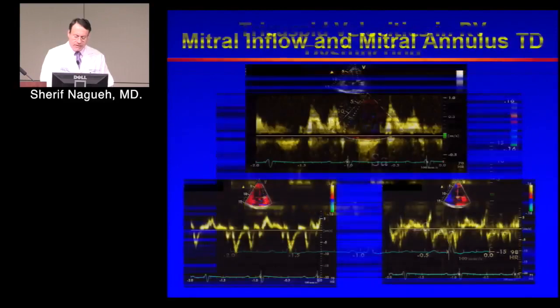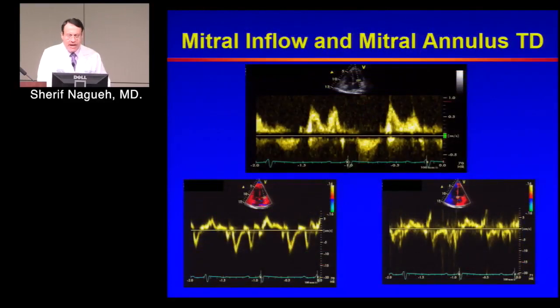One last point, sometimes we are asked, when patients have pulmonary hypertension, is this cardiac or non-cardiac? Straightforward findings that point to the etiology being cardiac, for example, mitral valve disease, bad mitral stenosis, bad mitral regurgitation, a lot of aortic stenosis and LVH. So I'm finding something. Coronary artery disease, depressed EF, congenital heart disease with, say, VSD and so on.